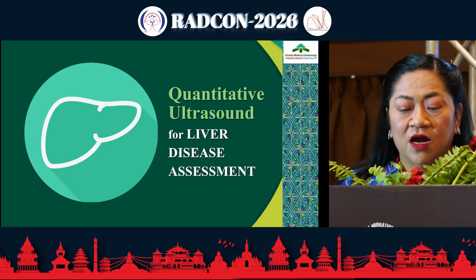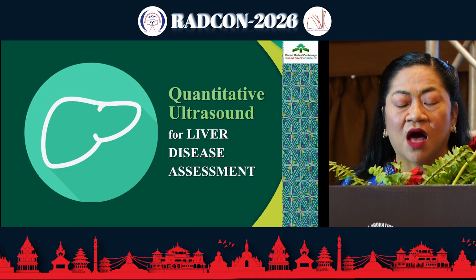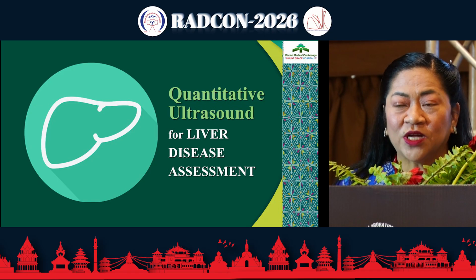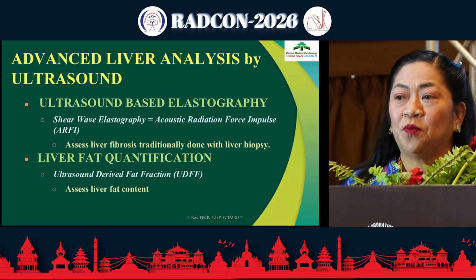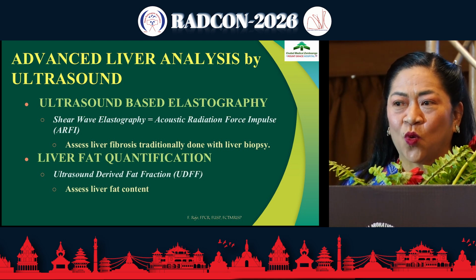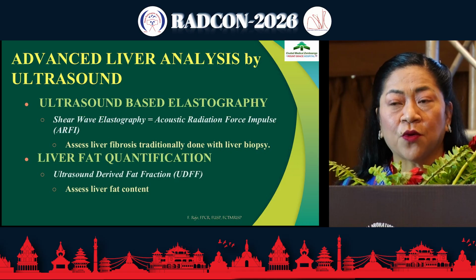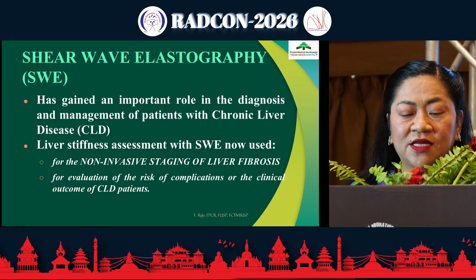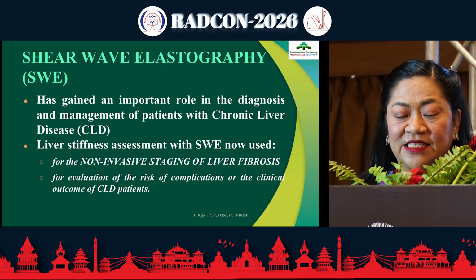quantitative liver ultrasound, that means we're going to be talking about ultrasound-based elastography, which is like shear wave elastography, and we'll also be talking about liver fat quantification. So shear wave elastography has gained an important role in the diagnosis and management of patients with chronic liver disease.